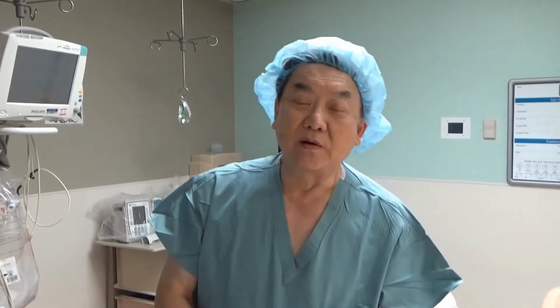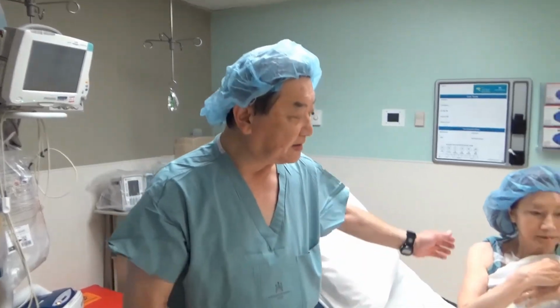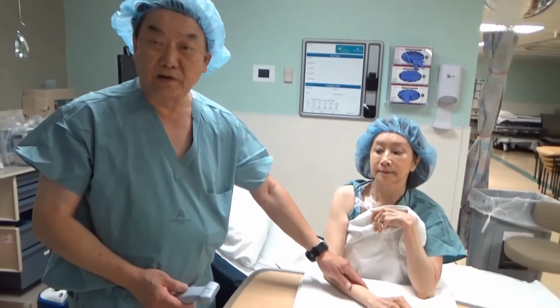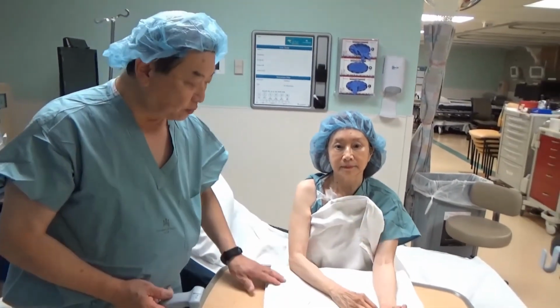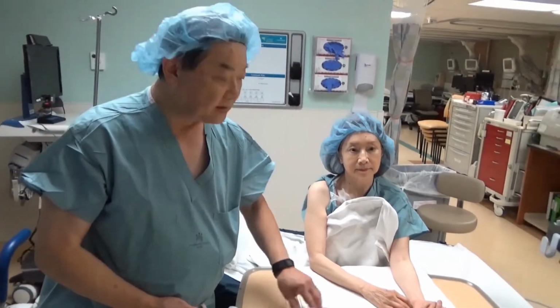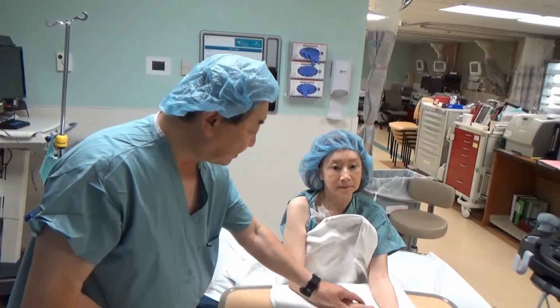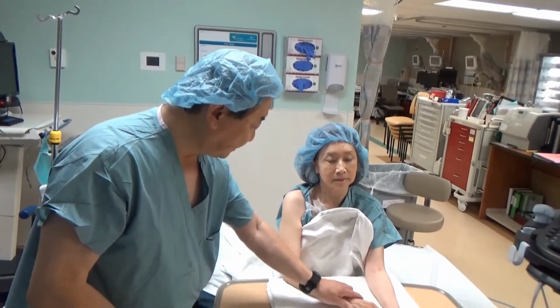Hi, we are now going to proceed with the demonstration on the lateral epicondylitis fenestration, or percutaneous needle tenotomy, of what's commonly called tennis elbow. So here you'll see Linda is sitting on the gurney and her arm is rested on a Mayo stand. I normally like to place a towel to have her arm rested, and then I have the arm slightly flexed.